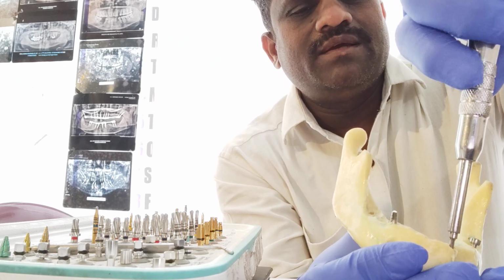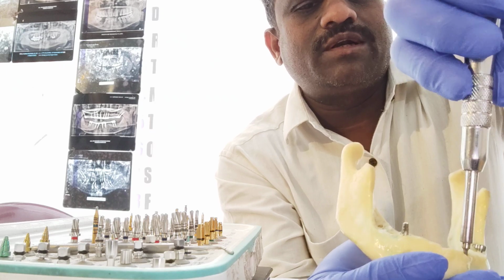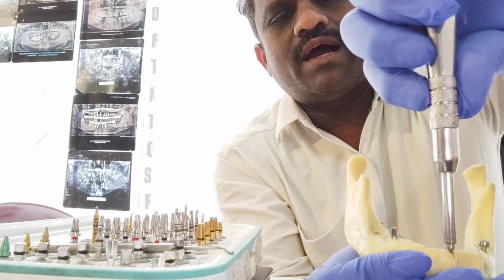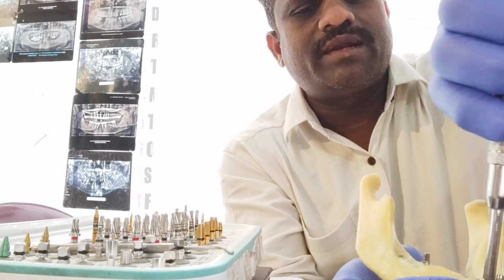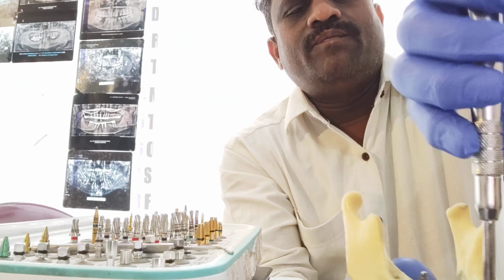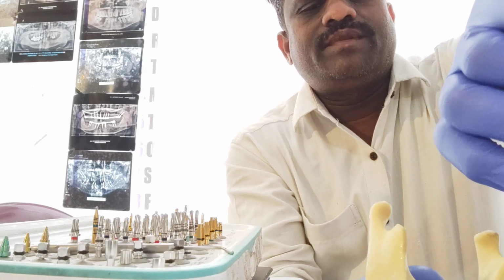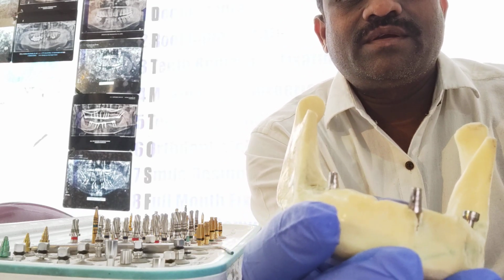This is a model. You will not have that much tightness and pressure and stability as you want. It's a model to explain. So now I have placed the implant in the anterior mandible. BCS, usually I prefer BCS in the lower mandible and the upper anterior maxilla also. So you will get good stability. Okay, so I placed it completely. You can have a look.